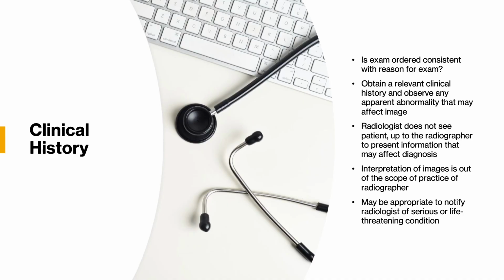When you take a clinical history, again, we're looking at the exam that was ordered, and is it consistent with the reason for the exam today? You'll obtain a relevant clinical history and observe for any apparent abnormality that may affect the image. Sometimes patients will have congenital conditions and they won't be able to be set up in that perfect A to P, P to A lateral image.